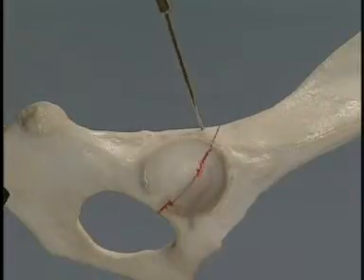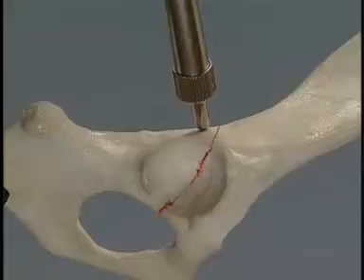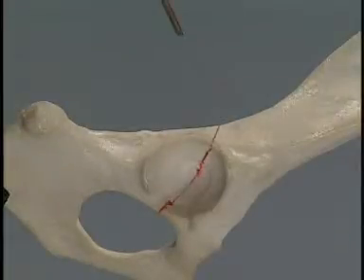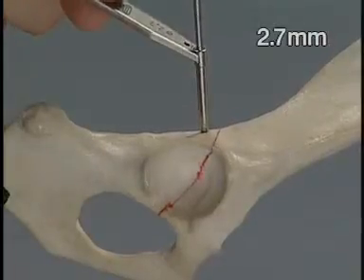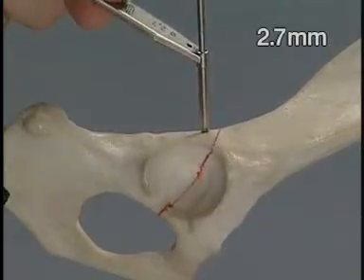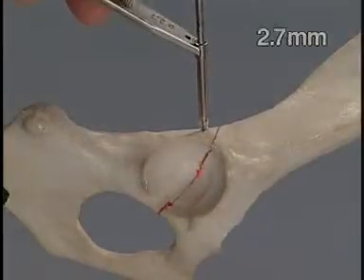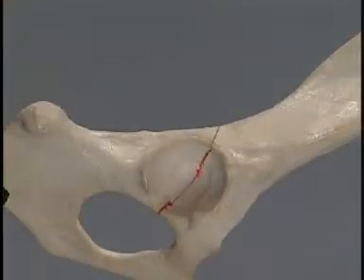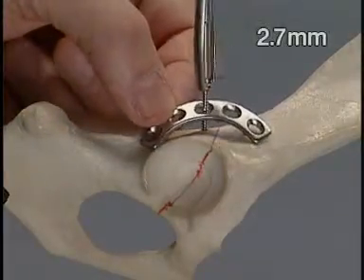The hole is measured, and 2mm are added to compensate for the thickness of the plate. The thread is cut in the bone with the 2.7mm tap through the double drill sleeve. The 2.7mm cortex screw is inserted through the appropriate hole in the plate.